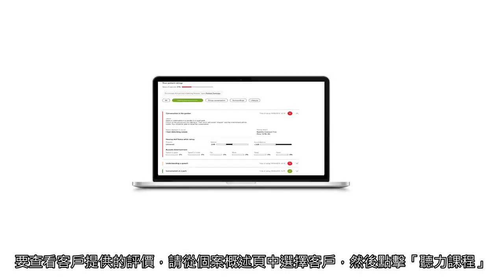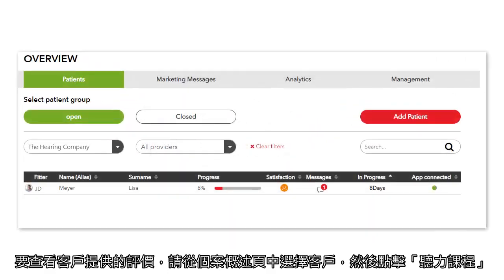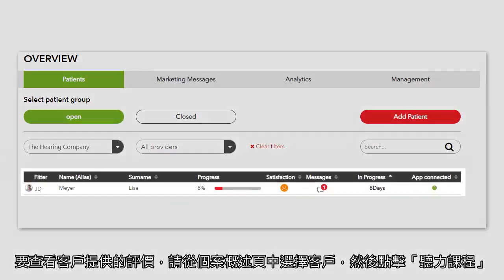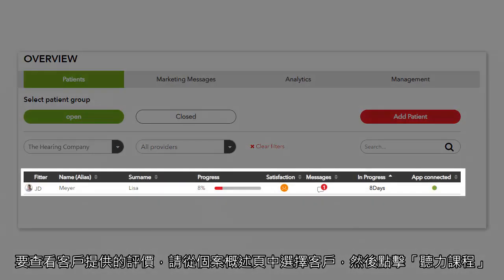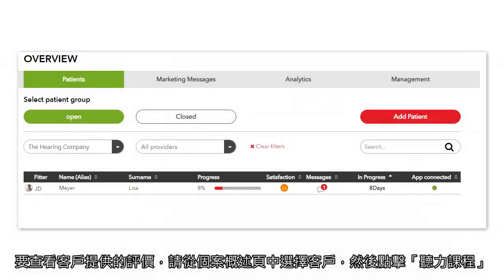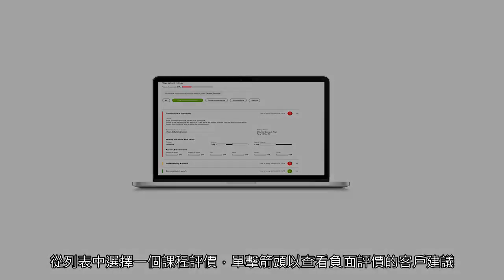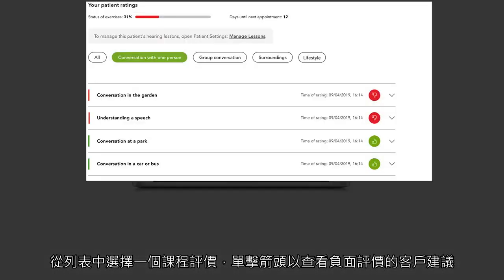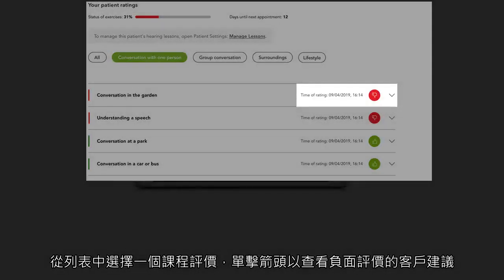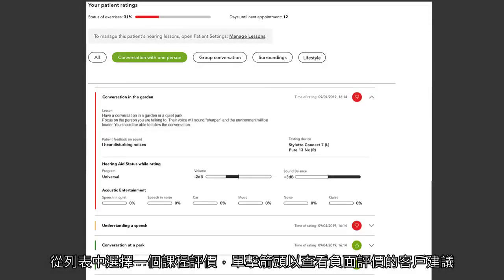To review the feedback your client provided, select the client from the patient overview and go to Hearing Lessons. Choose a rating from the list and click on the arrow to review the additional feedback provided in case of a negative rating.